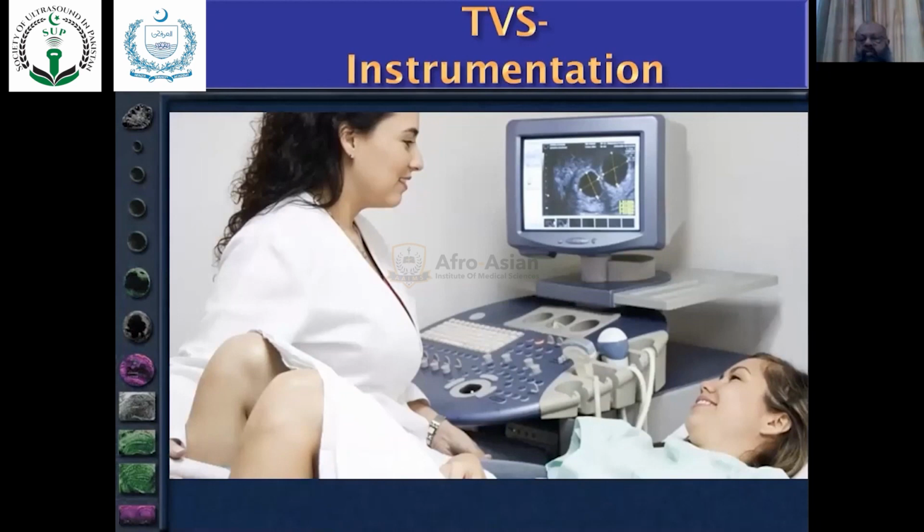The first part of this presentation is about TVS instrumentation. What are the instruments which we use?